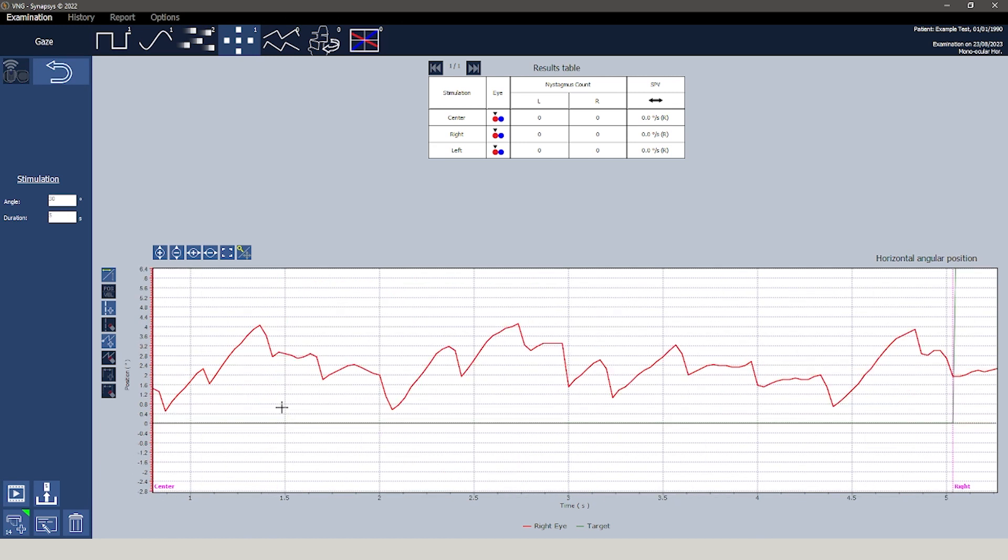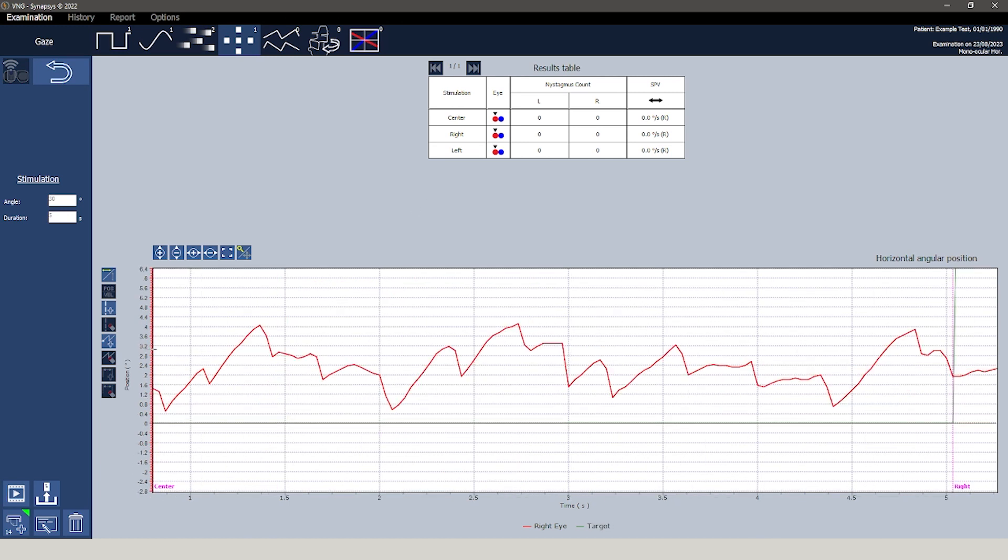Like the other modules, the lower section of the interface includes an angular position graph that provides a visual representation of eye movements relative to the target's movement. This feature allows for the option to switch between displaying vertical and horizontal movements.